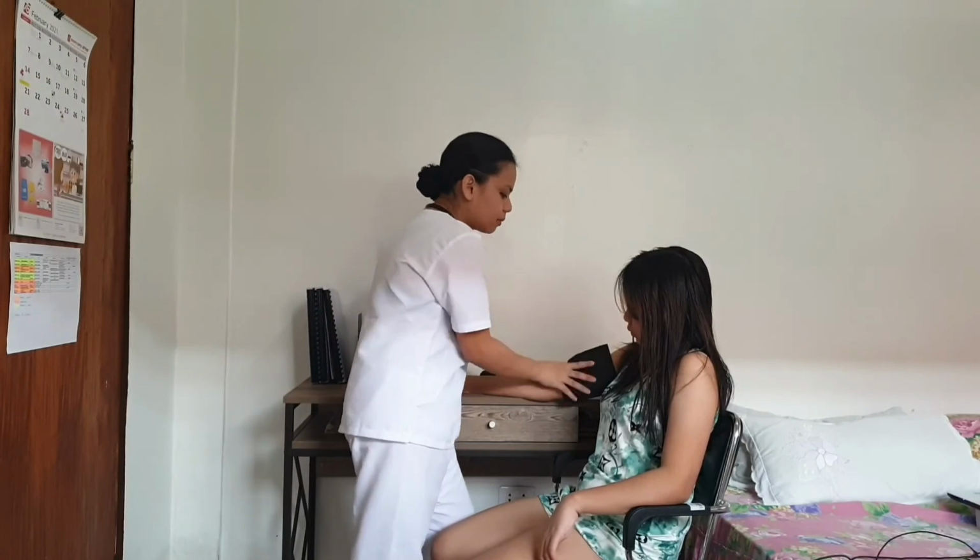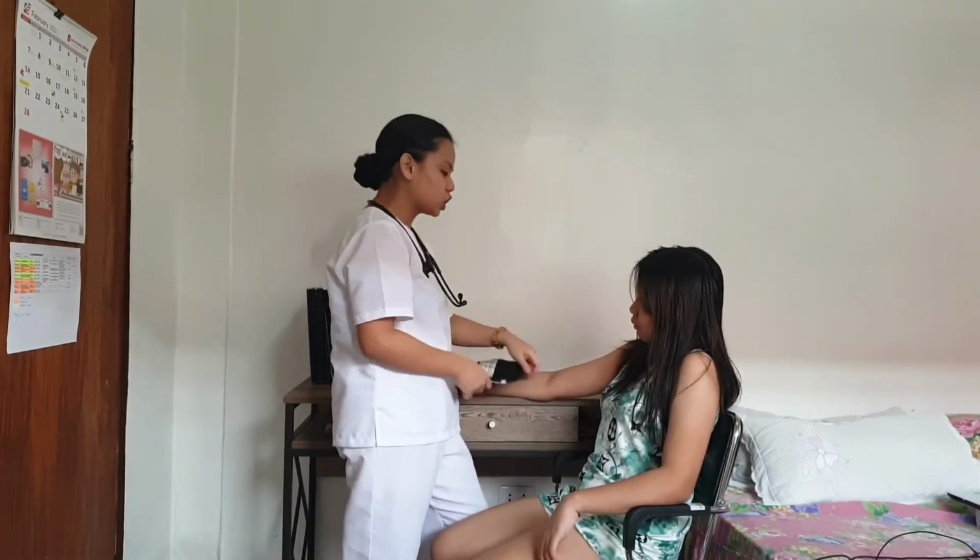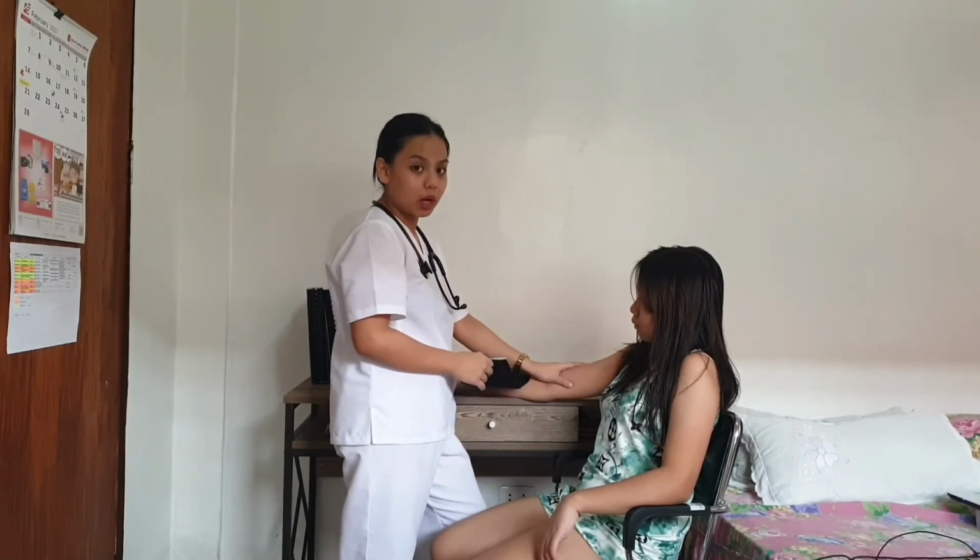So next, I am going to measure her blood pressure. But before that, I should let the patient rest for 1 to 2 minutes. Okay, ma'am, I gave you 1 to 2 minutes to rest because a waiting period gives the blood pooled in the veins time to be released. So now I am going to measure your blood pressure.